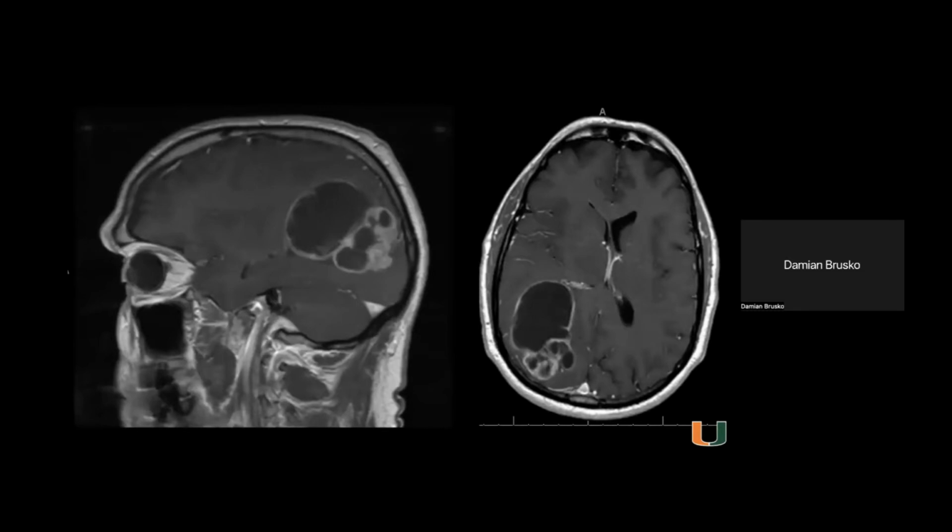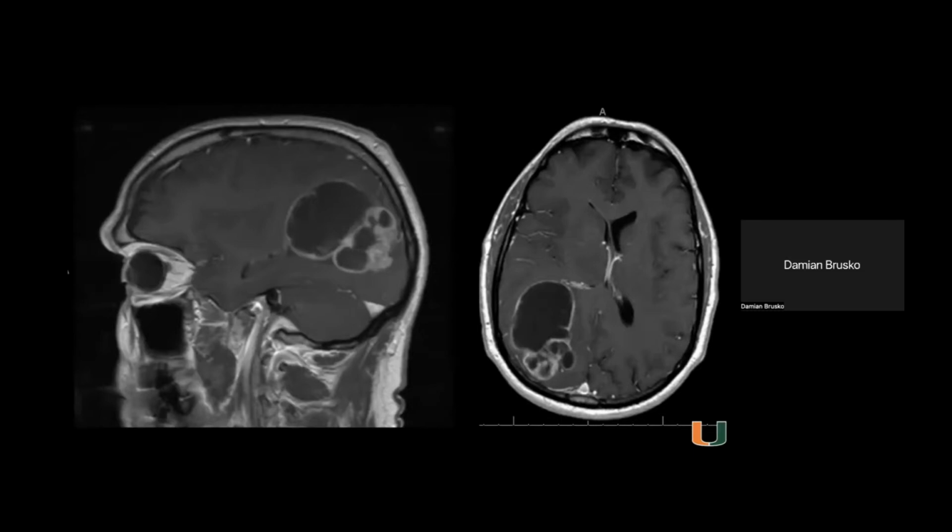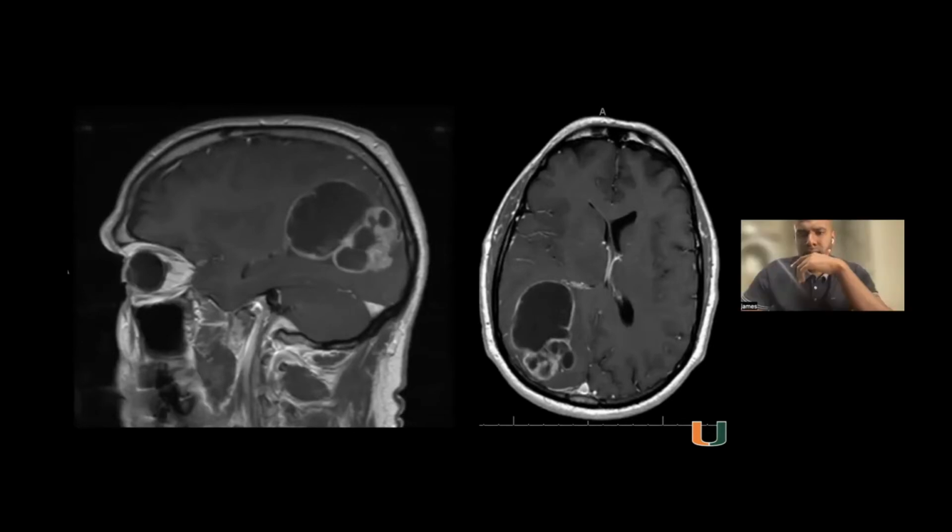And then positioning. You probably need a pretty large bump if you wanted to do it supine, or you could consider doing it in a lateral, right side up as well. Well, going along what you said, going along the long axis of the tumor, and you see on this sagittal cut, the most portion that comes right to the surface is that portion near the superior occipital pole. Working down the long axis, would you consider doing it prone?